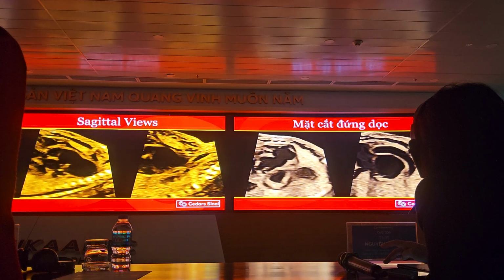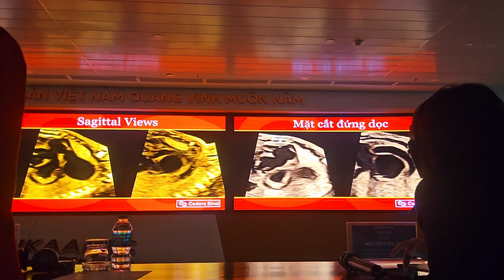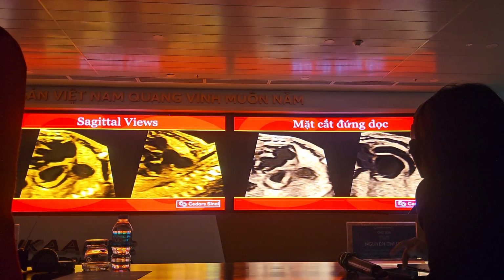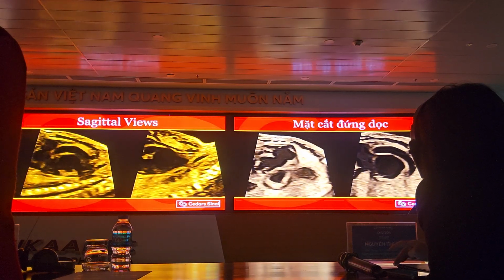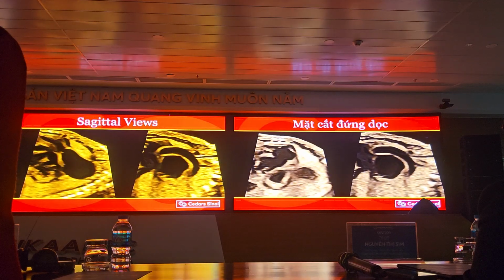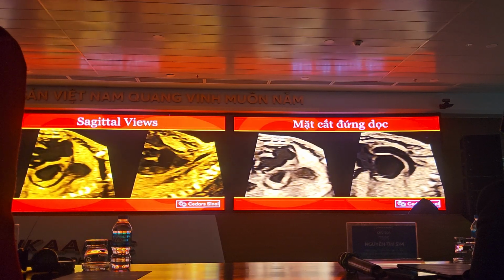Here you can see the trachea coming down. Right here you can see how it's narrowed. There's the aorta, there's the trachea, very big pulmonary arteries. Same thing over here. See these huge pulmonary arteries can cause obstruction, and some of these babies need to be intubated soon after delivery. Most are fine, but you just have to be prepared.